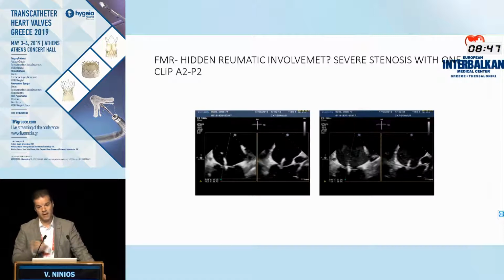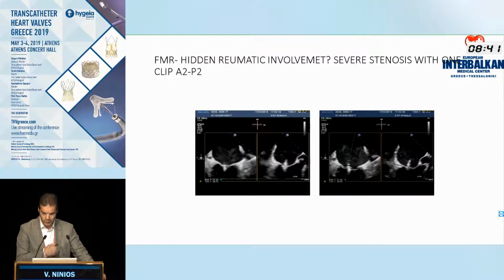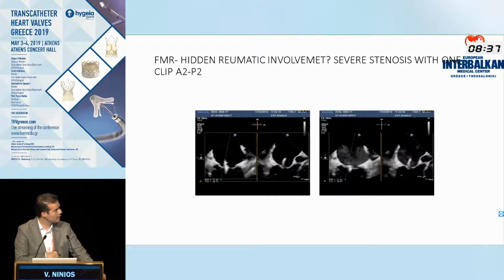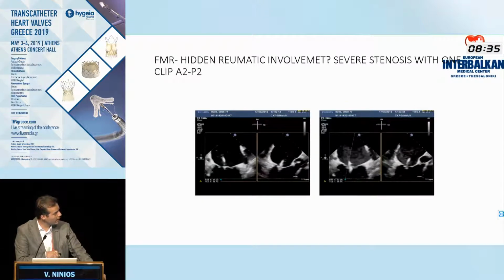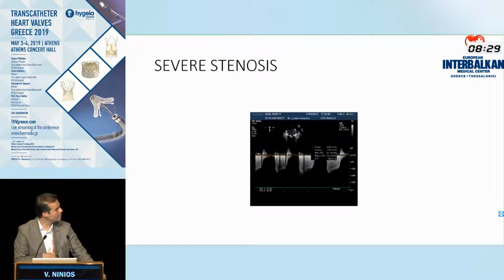But sometimes you have unpredictable things happening. This is another ischemic patient with functional mitral regurgitation. This is actually a reshaped patient. We put 1 clip straight in the middle of the jet. Look what happens to the left atrium. There's clouds there. Clearly, the valve is not opening. This is the commissural view. And the mean gradient went up to 13. Blood pressure went down. Forward flow went down. So clearly, this patient had developed severe mitral stenosis acutely.